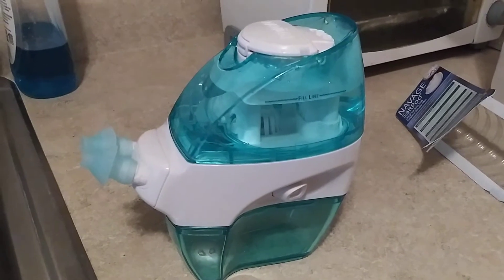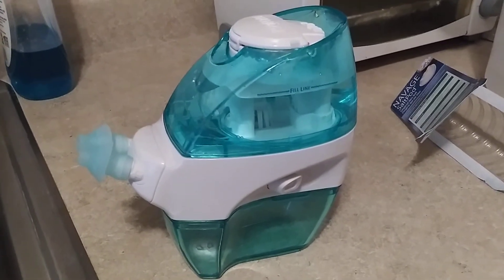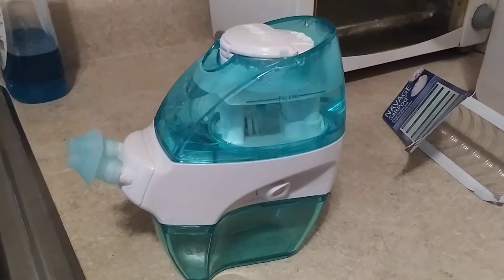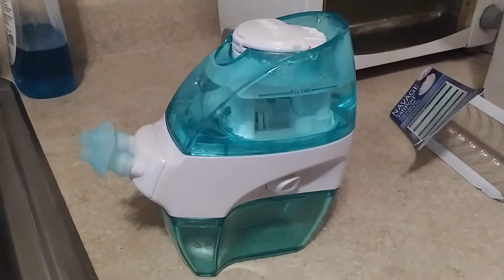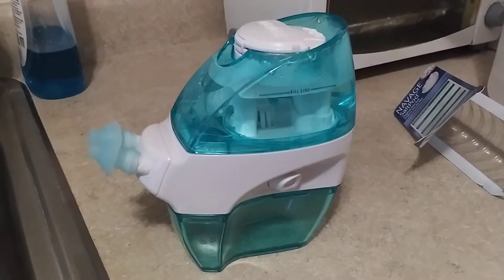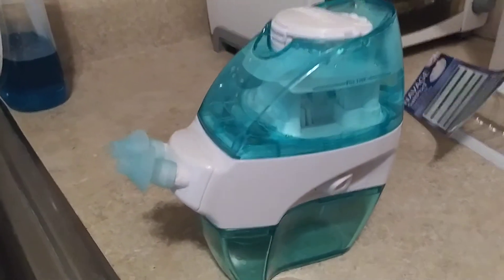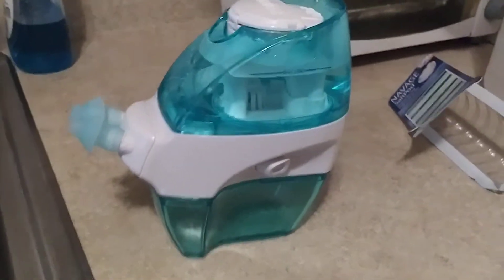If you do buy one of these, use it — it's not that bad. If I can use it, anybody can. You get a one-year warranty; of course my warranty expired, but it was basically brand new because I never used it. It was working good at first, but now I even went online with customer support.